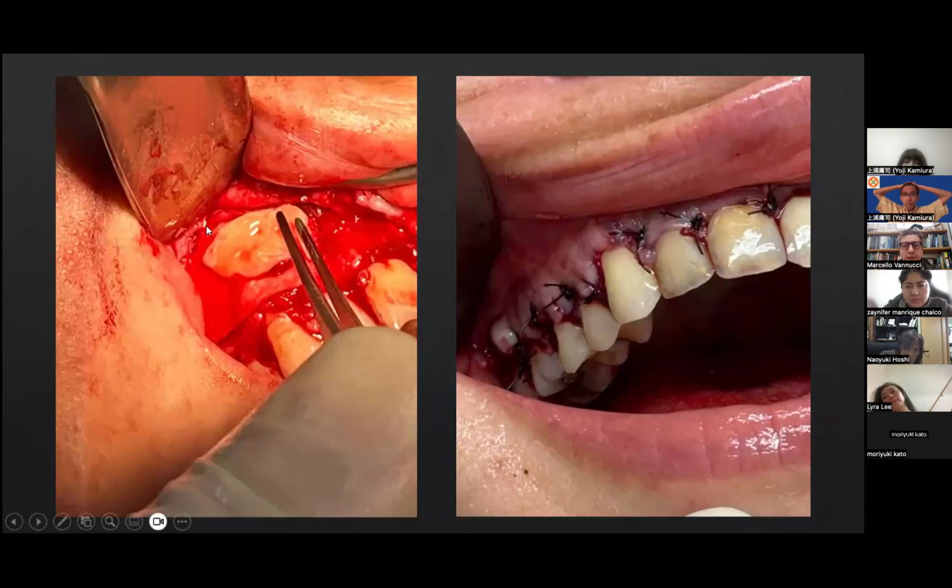After we have completely filled the lesion, we put the membrane, Tachygraft, and put over them LPRF in contact with the mucosa. And now we have the suture.